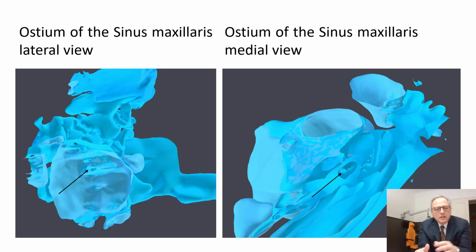Now, for example, I show you the view from the sinus maxillaris at the left side into the medial part of the nose. And at the right side, you have the view from the medial part of the nose into the sinus maxillaris.